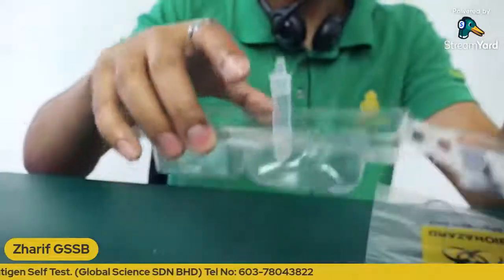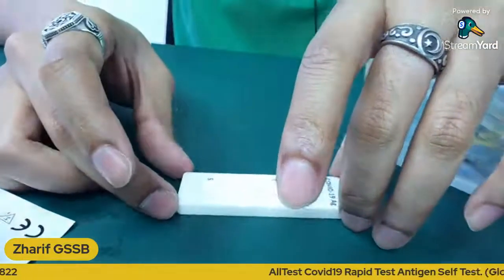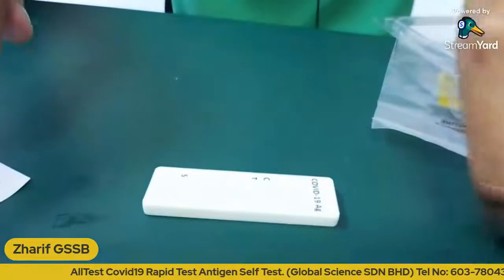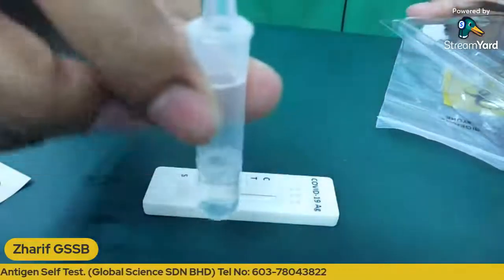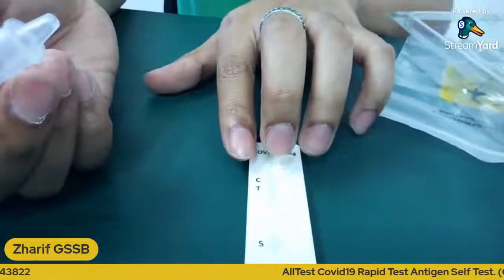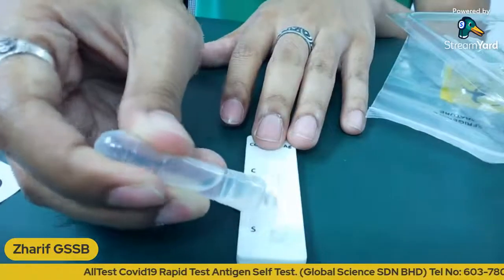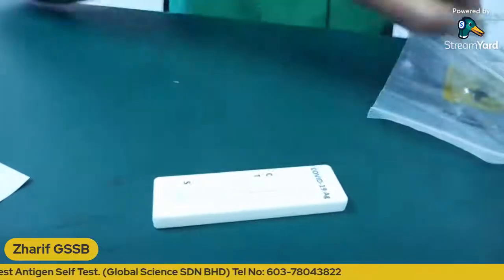So for you to apply your sample, you need to place your test device on somewhere flat, like so, if you can see it. Like that. And all you need to do is get your tube with your mixture and just apply 2 drops at the S. Only 2 drops. So 1 and 2. And that's all you need to do.